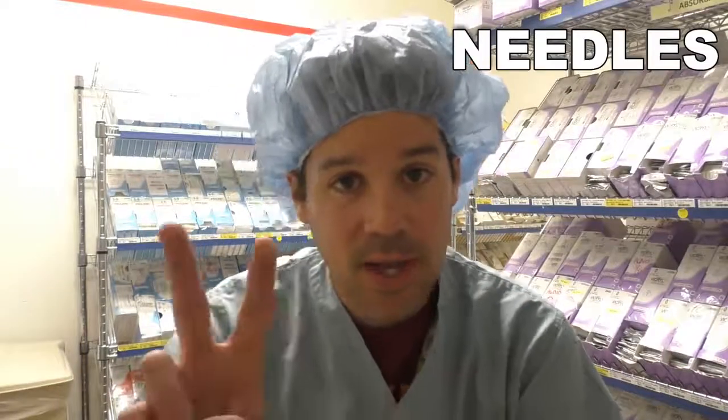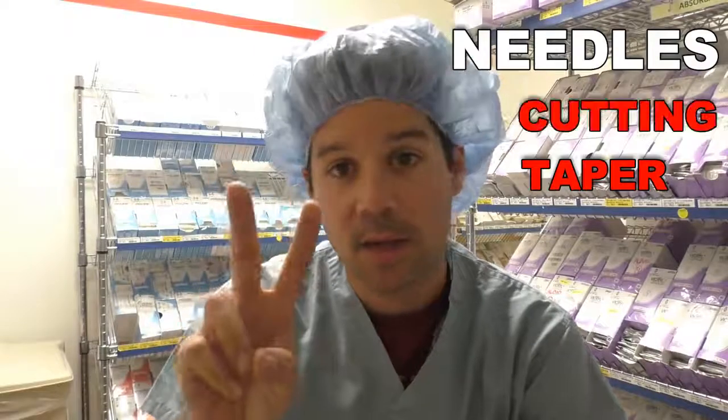Now, why is it used for closing the skin? That subcuticular layer right below your skin is really, really tough tissue. And you need a cutting needle to cut through that tough layer of skin to bring it all the way around and close up that incision. So that's it, needles. Two categories, taper and cutting.